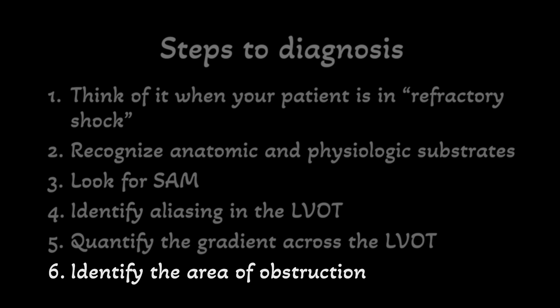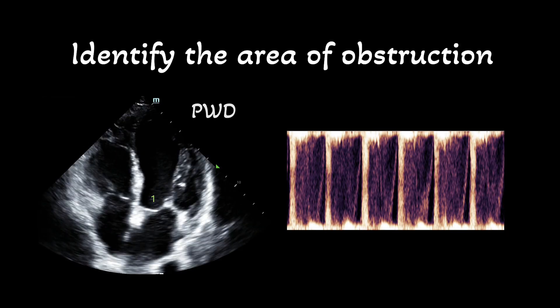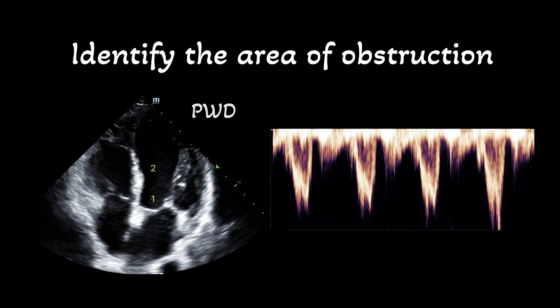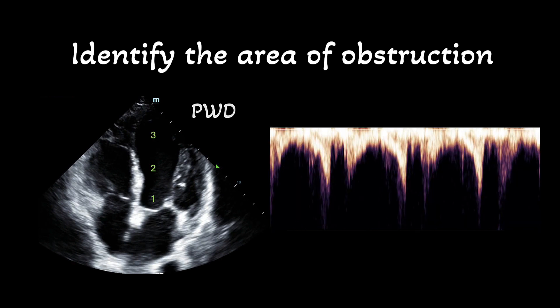Finally, identify where the obstruction is occurring — whether it is at the LVOT or somewhere in the mid-cavity of the left ventricle. To do so, walk your pulse wave Doppler signal up the LV. Start at the LVOT; as you can see here, the pulse wave Doppler tracing shows aliasing, demonstrating high velocities and obstruction. In the mid-cavity, the pulse wave Doppler signal shows a clear envelope, indicating normal velocity flow. At the apex, the pulse wave Doppler signal also does not demonstrate aliasing. Thus, the area of obstruction in this case was at the LVOT.